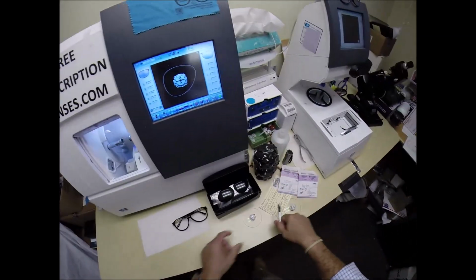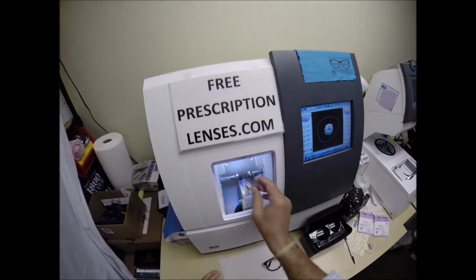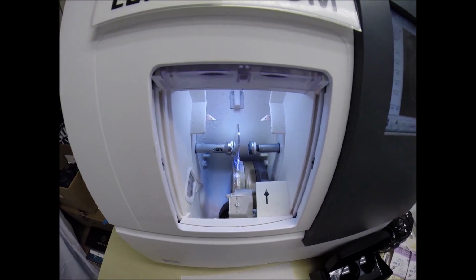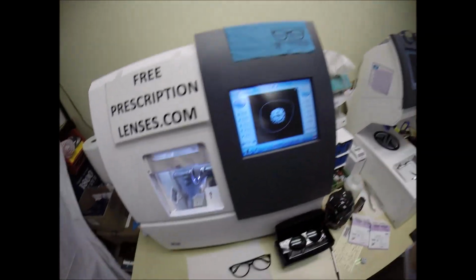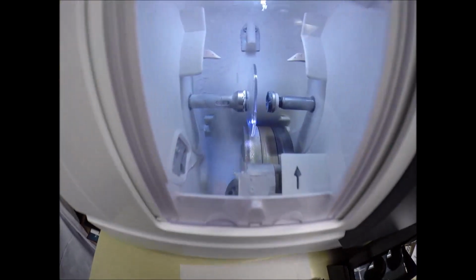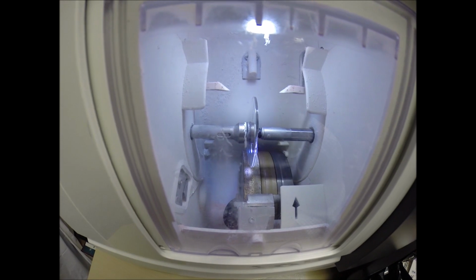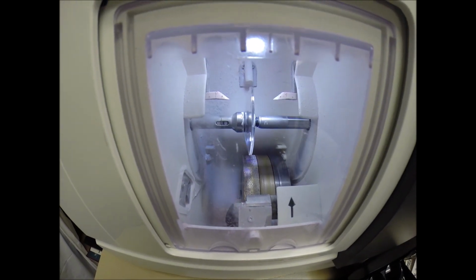Let's take the lens, press down firmly, put it into the chuck, or as I like to call it, the Charles, because I don't know this machine well enough to call it chuck. Hit the green arrow, which is start in every language. The door closes, the clamp shuts. The lens is going to be traced by 2 white styluses, making sure that it's large enough to fit into the frame, which it is.